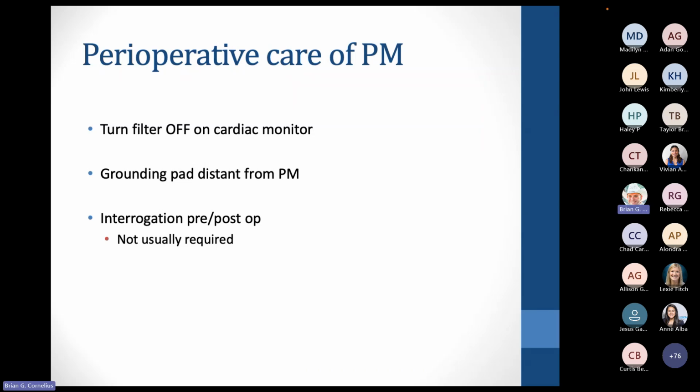So what do we have to do as far as pacemakers in the perioperative setting? A couple of different things that you have to think about. One is how you can safely manage this patient. Two, what do I need to change, or do I need to change anything? A lot of what you'll see depends on the facility itself. Some places you'll have an EP service. They may need to come evaluate the patient or interrogate the patient's AICD or pacemaker beforehand.